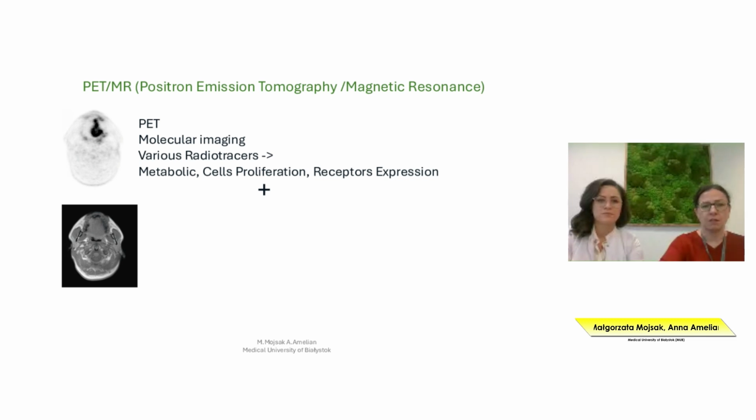Additionally, in PET-MR imaging, the resonance is not only the imaging that provides anatomical or morphological information or the information on the location of lesions.